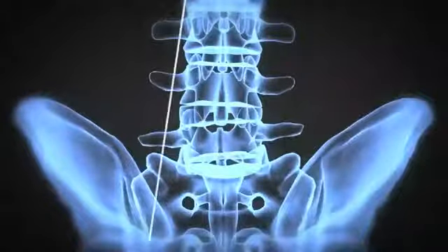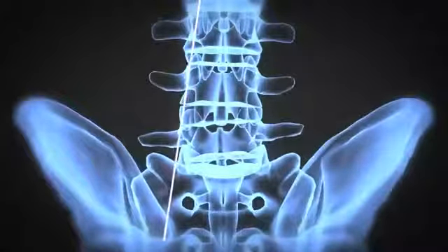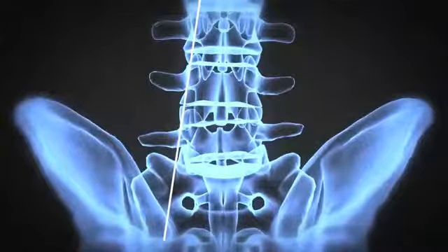Next, use AP fluoroscopy to align the guide wire along the lateral borders of the pedicles to be instrumented.